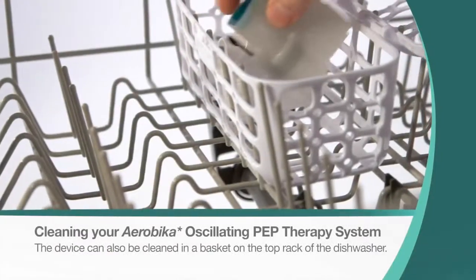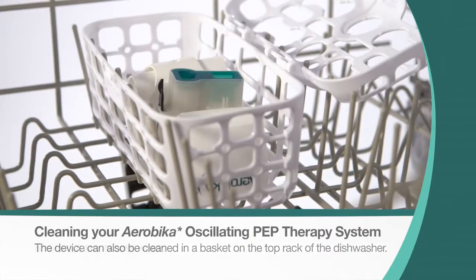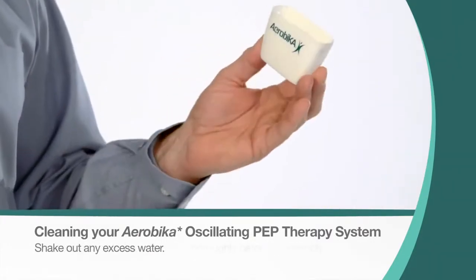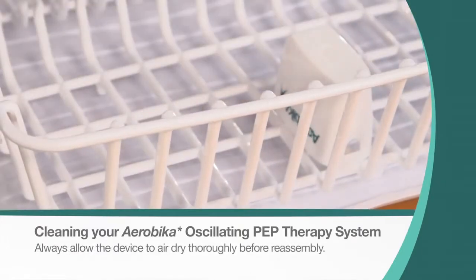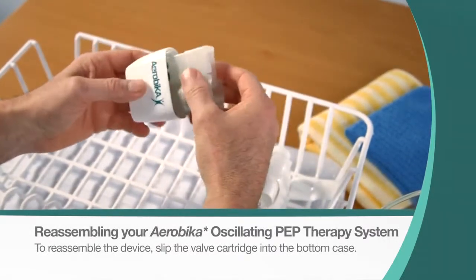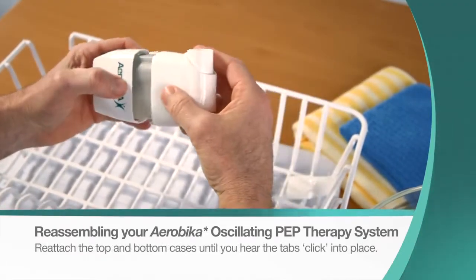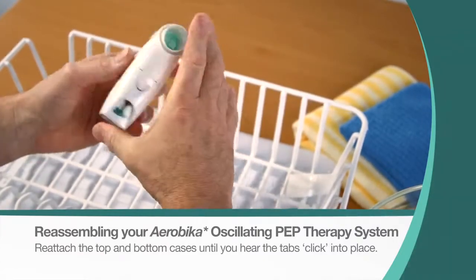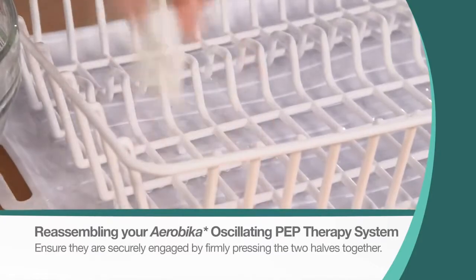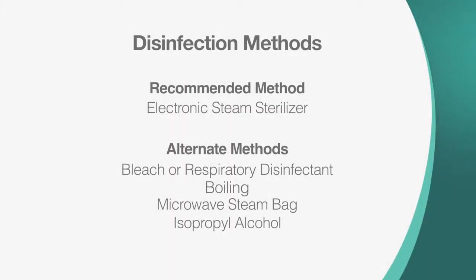The device is also dishwasher safe. Secure the device in a basket on the top rack and run through a light or normal cycle. Shake out any excess water and always allow the device to air dry thoroughly before reassembly. To reassemble, slip the valve cartridge into the bottom case. If it does not fit, rotate the cartridge and try again. Reattach the top and bottom cases until you hear the tabs click into place, and ensure they are securely engaged by firmly pressing the two halves together. Reattach the mouthpiece. The Aerobica Oscillating PEP device should be disinfected once each treatment day using any of these methods.